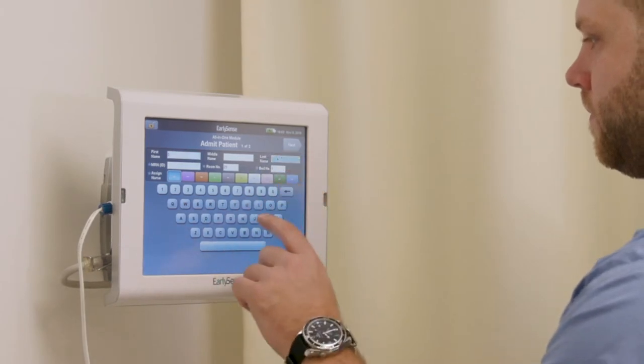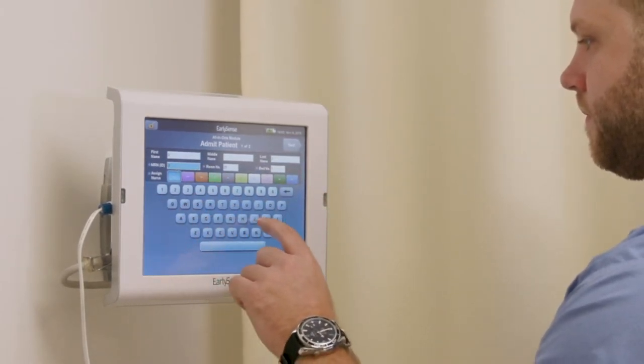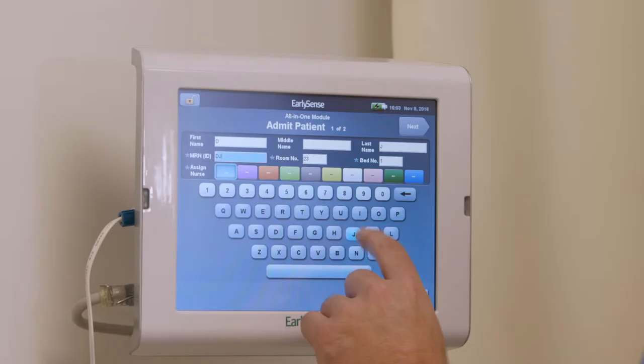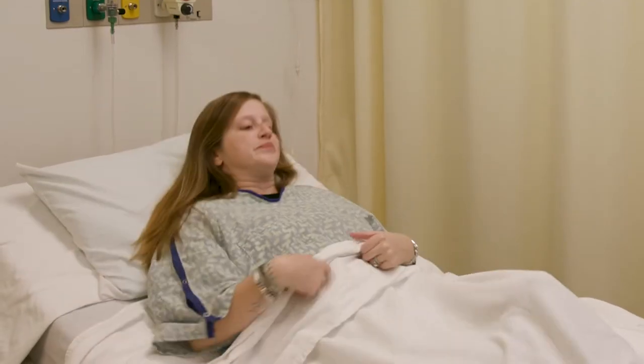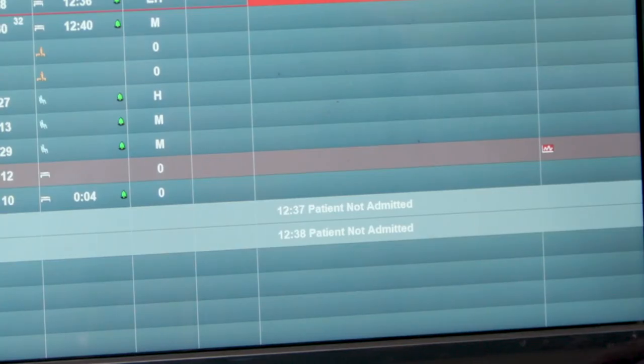ID, room number, and bed number must be entered for the patient to be admitted. If the bedside unit is connected to the EarlySense CDS, choose a color to assign the patient to a nurse. If a patient is in bed for 15 minutes or more but was not admitted, a message will appear on the CDS indicating that the patient was not admitted.